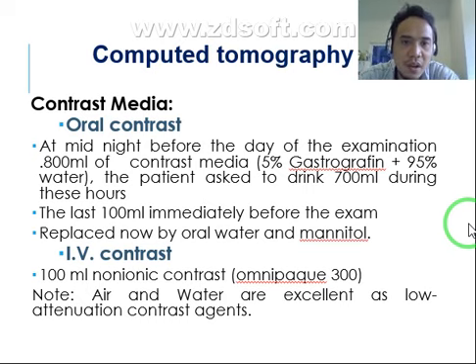So, for oral contrast, at midnight before the day of the examination, 800 ml of contrast media with at least 5% of gastrografin and 95% of water is administered. Patient asked to drink 700 ml during these hours and the last 100 ml immediately before the examination. Replaced now by oral water or mannitol.